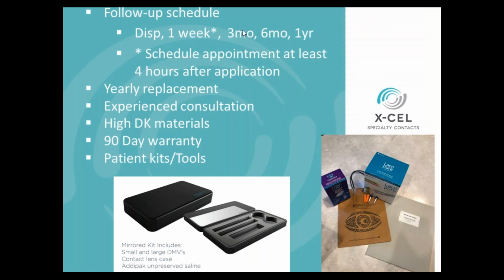I would also say that due to most warranty periods being at that 90 days, I would be scheduling that patient right at that 90-day warranty period. Now, we say 90 days, and we have actually extended this warranty period due to the circumstances we are now under in some situations, because you do have lenses sitting in the office waiting for patients to come in, and we're obviously on restrictions with that. So that's something you can find out from our consultation or through your account rep. But see them at that 3-month window if you do have a 90-day warranty, just in case you have to make an exchange. We say these are yearly replacement lenses.